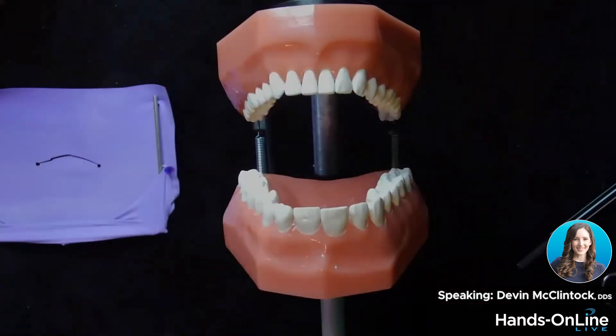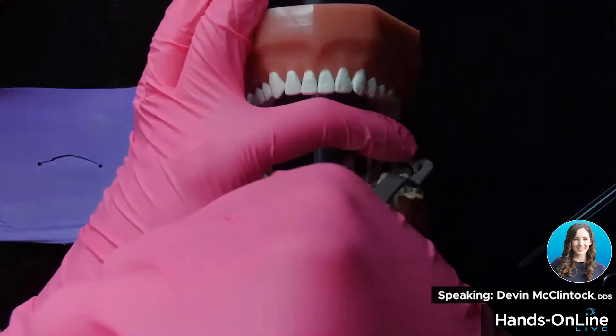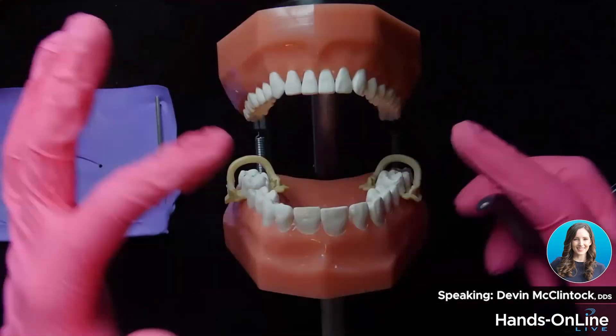The way I'm going to do this is with the Kerr clamps, but you can use pretty much any clamp. If the patient has a lot of sensitivity, you can always give them a little bit of anesthesia — you don't have to do a full amount, just a little bit right around the gums so that it's a little bit more comfortable for them. You just place those clamps supragingival and they're sturdy — they're not going anywhere.